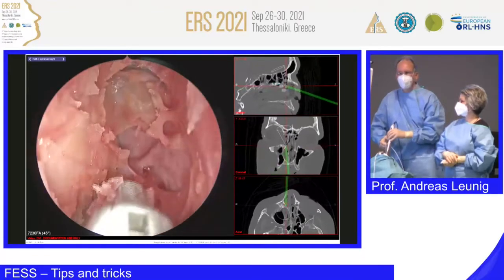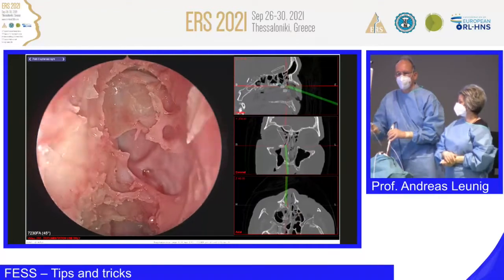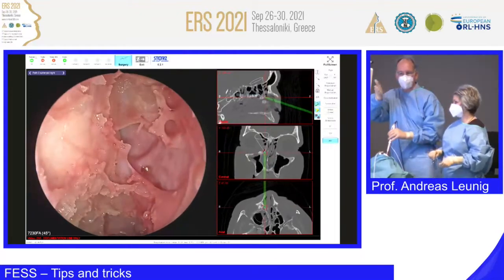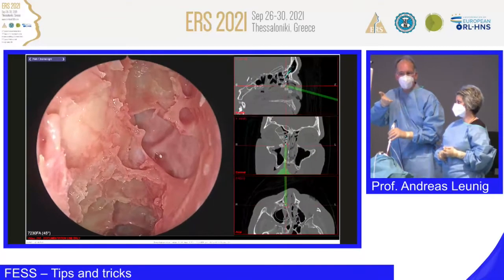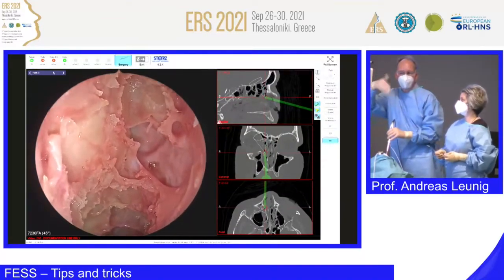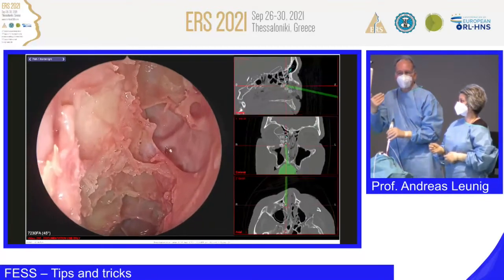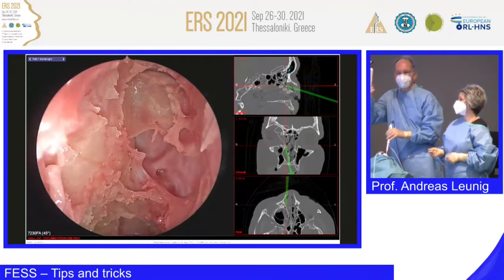And in case of Graves' disease, when you have endocrine orbitopathy, you can decompress the orbit. That's done very easily by removing a part of the lamina papyracea and the floor of the orbit until the level of the infraorbital nerve. And then you make a longitudinal and a crosswise incision of the periorbit so the fat can come out, but pay attention not to block the outflow tract of the maxillary or frontal sinus.